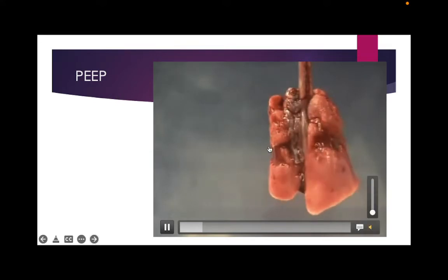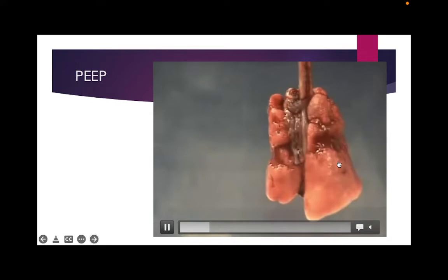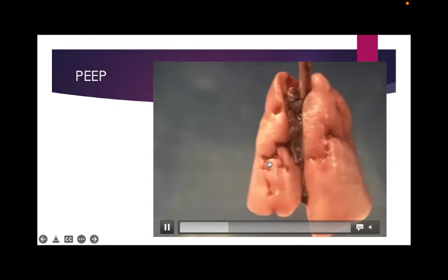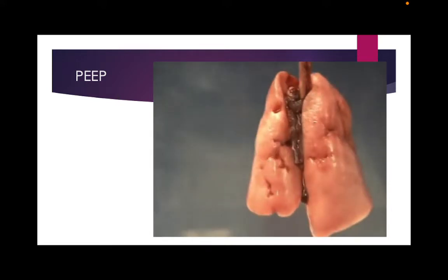Okay, so now we're on no PEEP. So notice as the lung inflates, there's these areas here that are not participating in gas exchange. You see that? Right? Now they've applied some PEEP. What do you see happening to those areas?